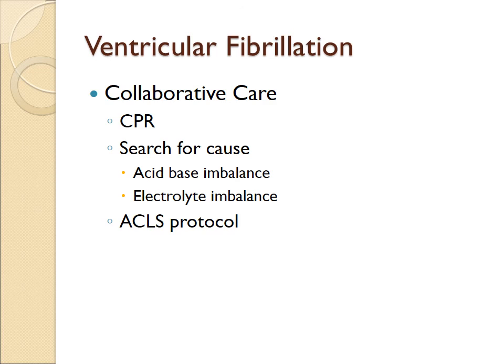Really, the way this all happens is you see VF on your screen and you go running into the room. And when you go running into the room, you pray to God that they're shaking their leads again. But the patient's unresponsive, and we find that that's not true. So then we're going to start CPR, call for help, and initiate the ACLS protocol.